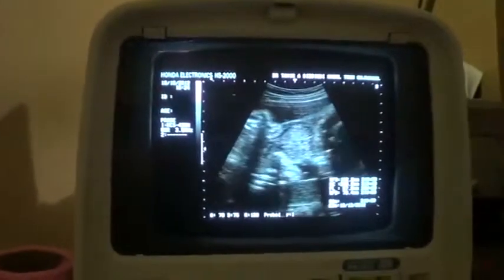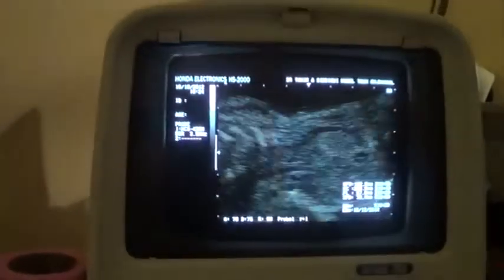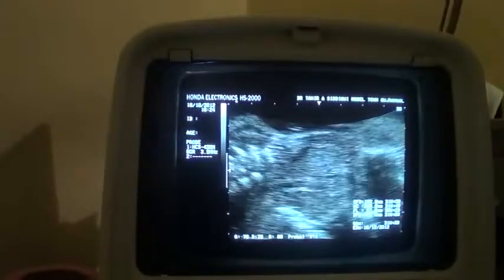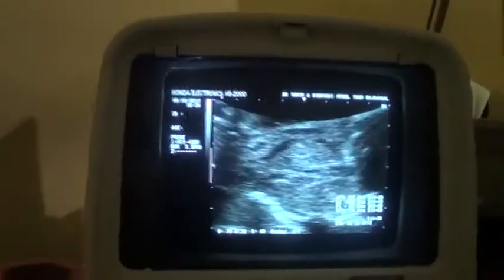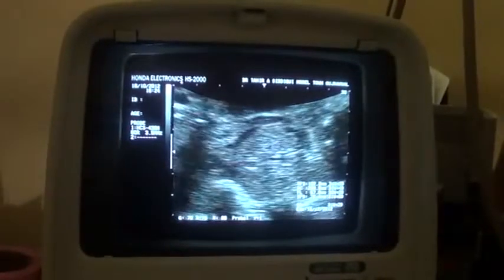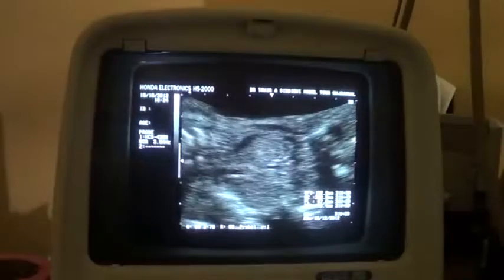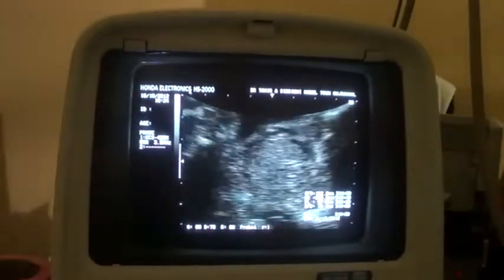Now, I am going to magnify this mass, and then I would like to study and see it's a bilobe shape of a mass with a vessel passing through the center of it. There we are.